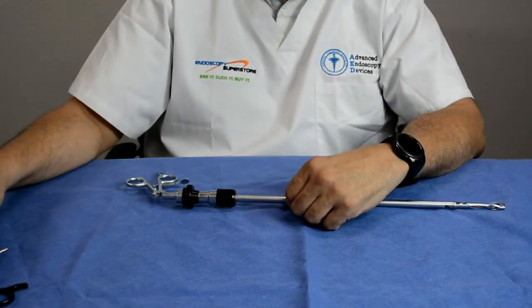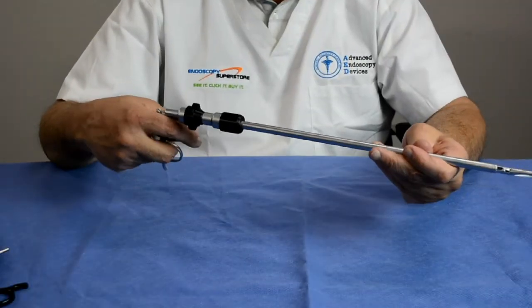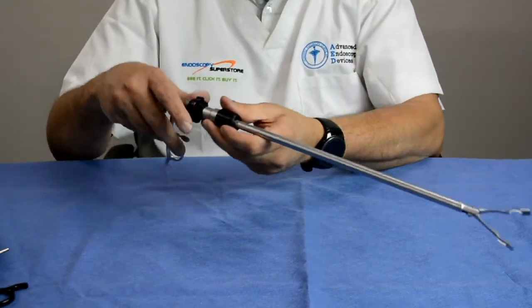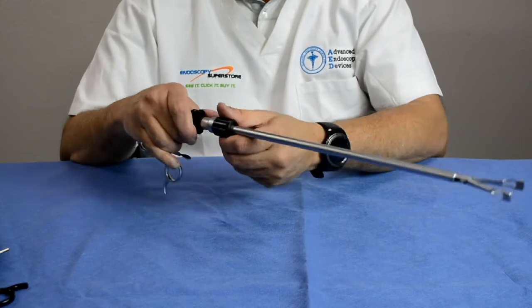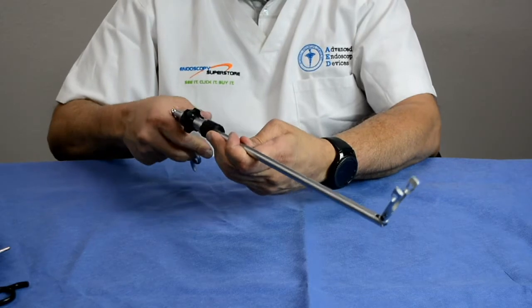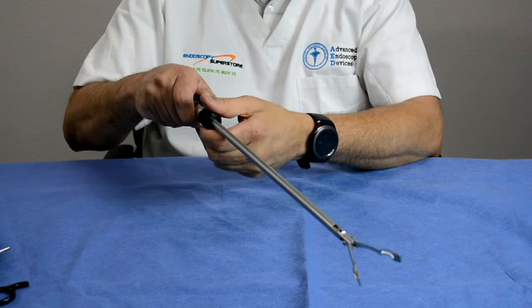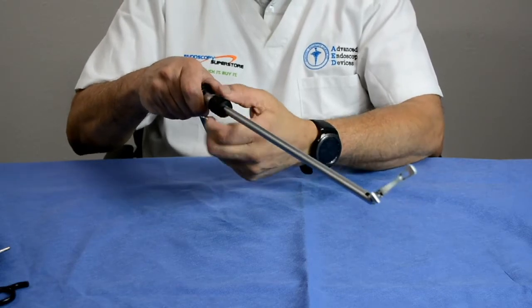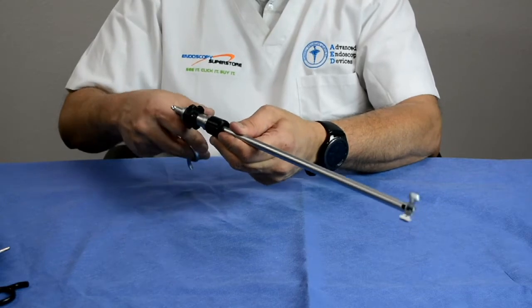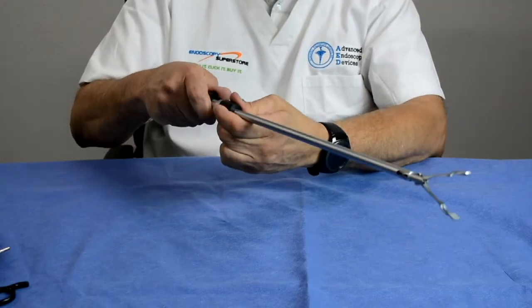As procedures became more intensive and intricate, doctors asked for the ability to articulate the jaw itself. So the next development from Advanced Endoscopy allows the forcep to be straight while you articulate the jaw to whatever angle you want — up to about 80 to 85 degrees — so you can get into the precise position needed. This is the next evolution of the laparoscopic forcep.